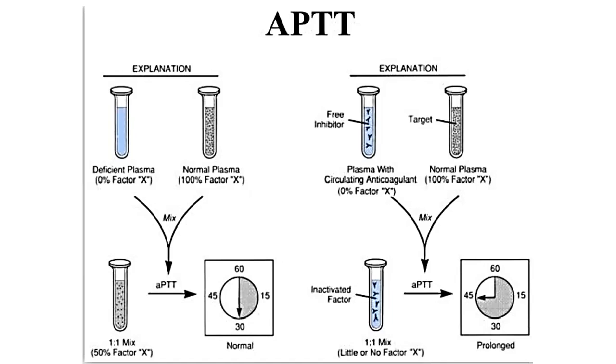Paano nato na-confirm na ang sample sang pasyente deficient sa clotting factor 10? Because pag mix naton sang plasma nga may clotting factor 10, gulpiyada ang iya APTT nag-normal. Nag-normal siya. That means may deficiency sa clotting factor 10 ang pasyente. That's how we confirm what specific clotting factor the patient is lacking.